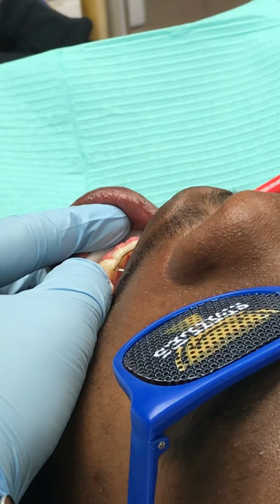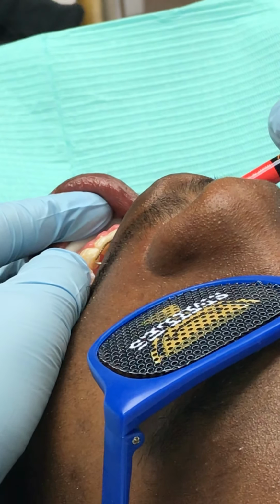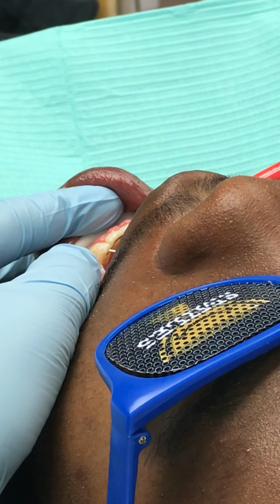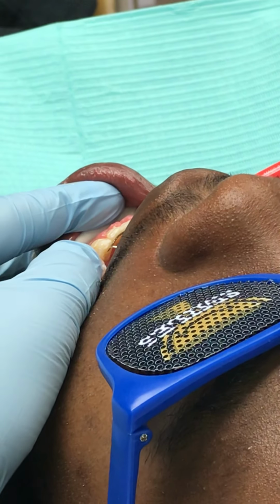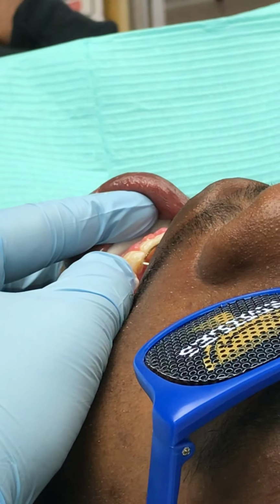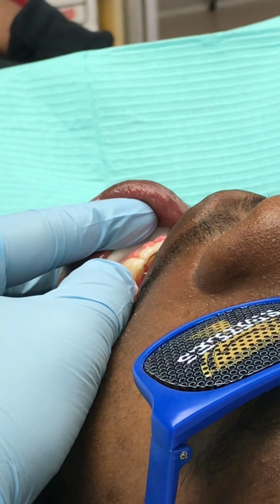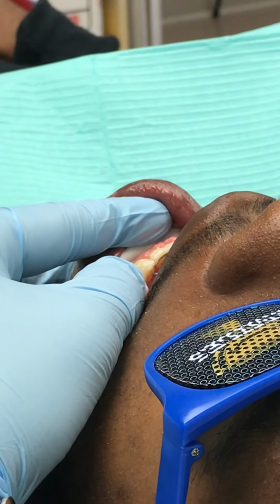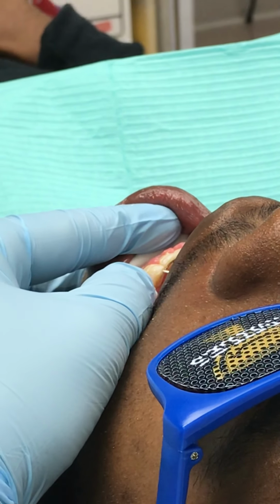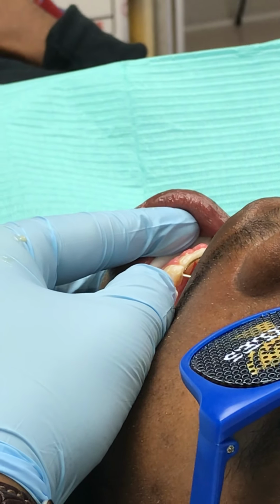And we're going to start by adding the adhesive on the lingual aspect of the wire. I have the syringe tip touching the enamel, and then I go up over to the incisal aspect of the wire, and then I go right over the wire. So I've basically made 3 stripes. I've gone gingival, incisal, and then right over the wire. And the whole time I'm making sure to touch the syringe tip to the enamel to make sure that we don't create any voids or discrepancies in the fill of the placement of the adhesive.